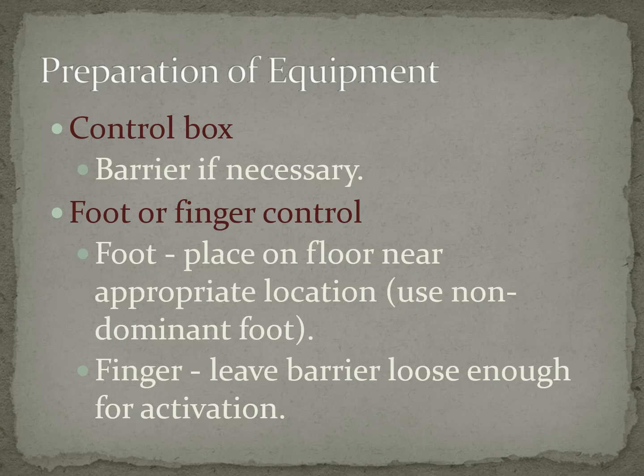Place the foot control. We have foot controls for ours, so place that foot control on the floor. And always use your non-dominant foot when you are using the rheostat. And I know that's difficult, but I want you to get into the habit of that, whether you're polishing or whether you're using an air polisher or an ultrasonic scaler, non-dominant foot should be operating the rheostat.